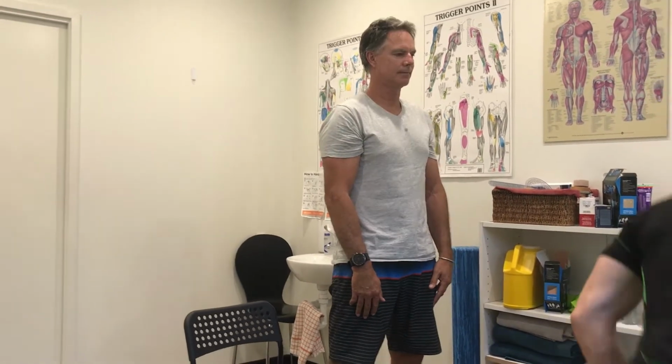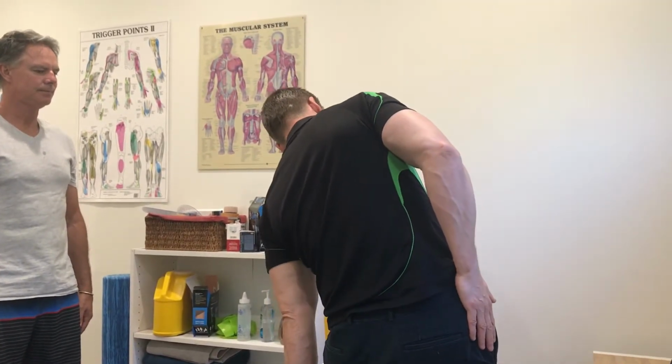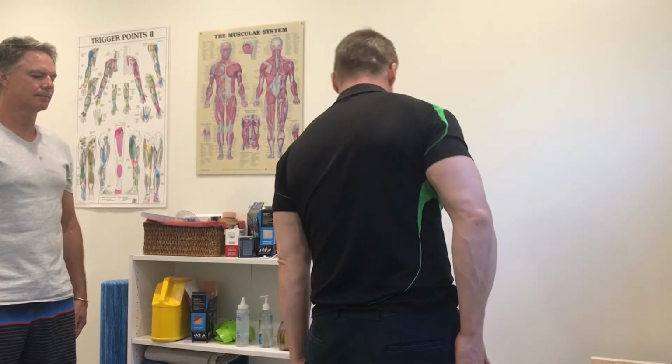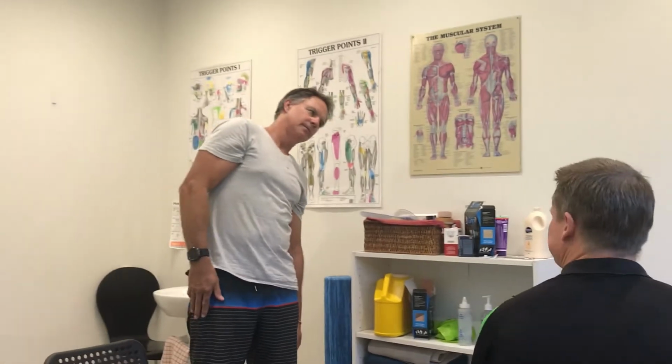Side flexion next. We'll start with the left side, so you're just going to keep your hands on your leg, slide it down to here wherever you get to, back up, trying not to lean forward as you're doing it. So it's going to be 3 left and then 3 right afterwards.